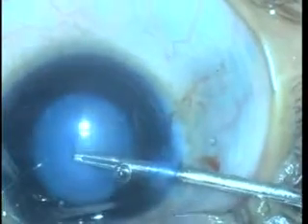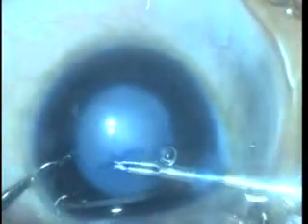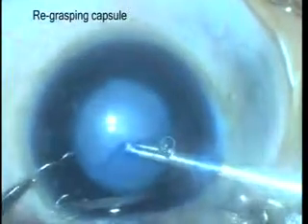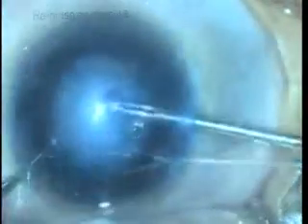The rhexis forceps provides good control of rhexis centration, size, and regularity. The lens capsule in children is elastic and prone to extend to the periphery. Frequently re-grasping the capsule prevents peripheral extension.